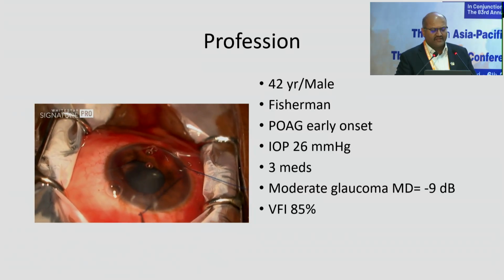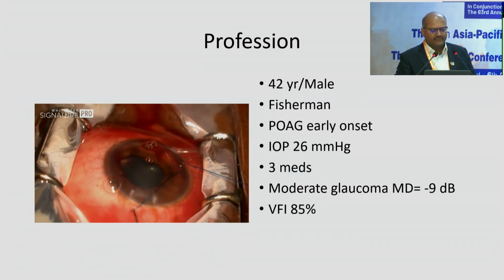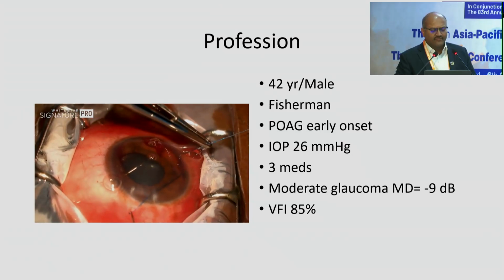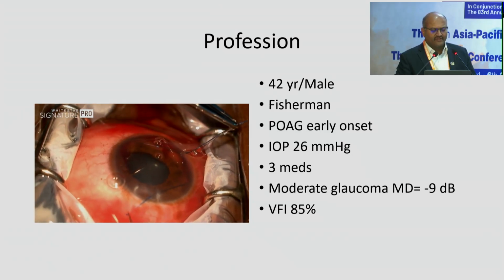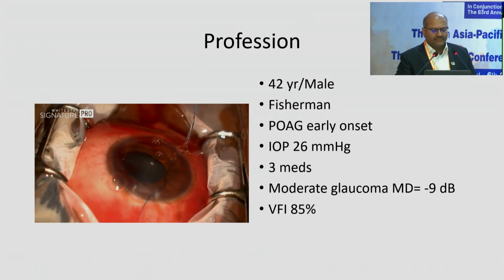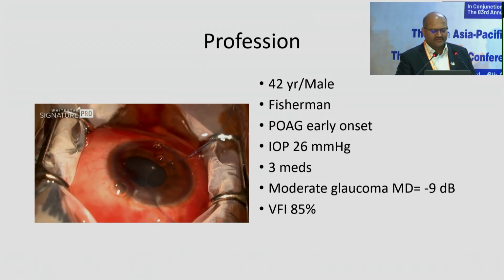You can see that the eye is phakic. It's not a pseudophakic eye, it's a phakic eye, so this can be done comfortably in phakic eyes also. Many of our initial learning we did in phakic eyes. And they respond quite well. They do very well for almost 3 to 4 years without medication.